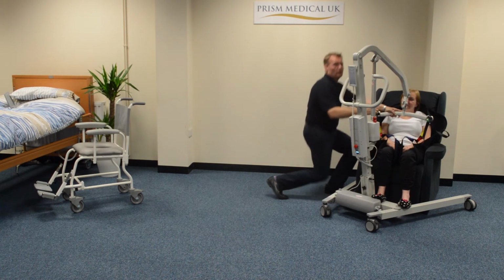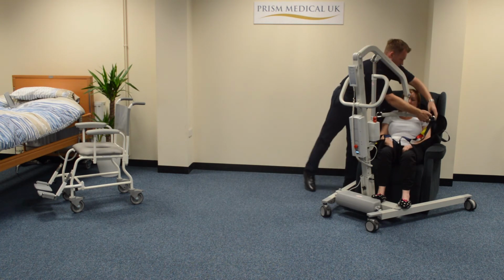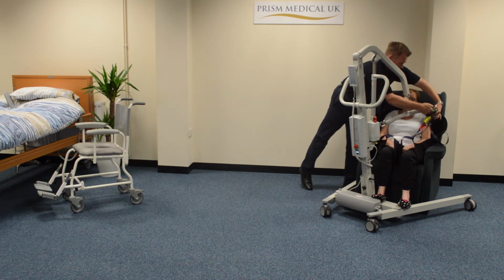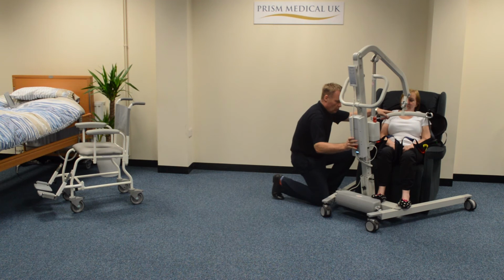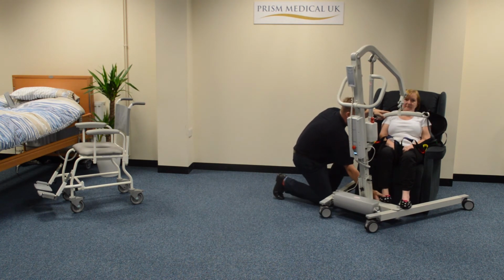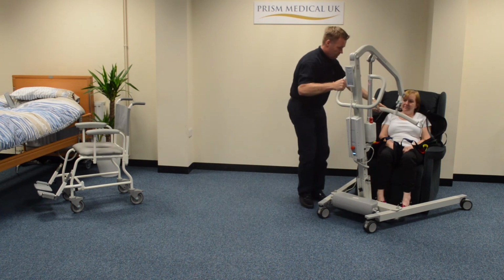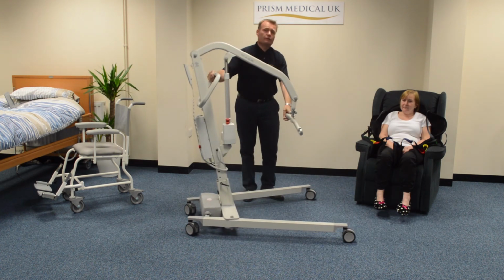Once we've lowered it sufficiently, we can now remove the straps. Pull the hoist out slowly, reposition Mary's feet. And then away, and that's transfer complete.